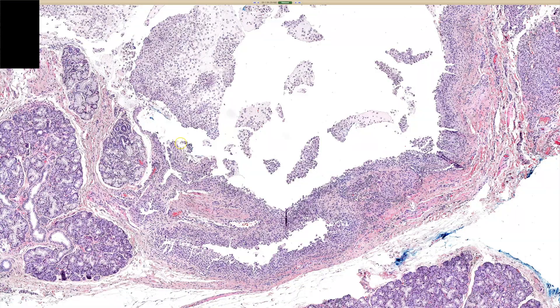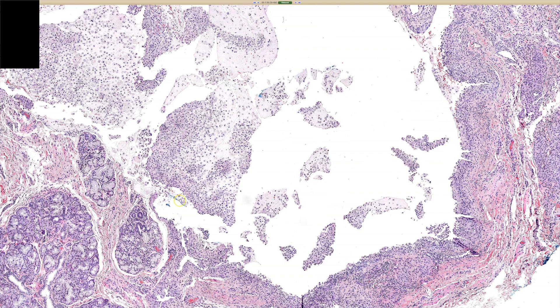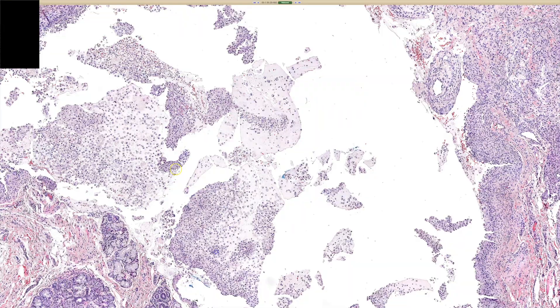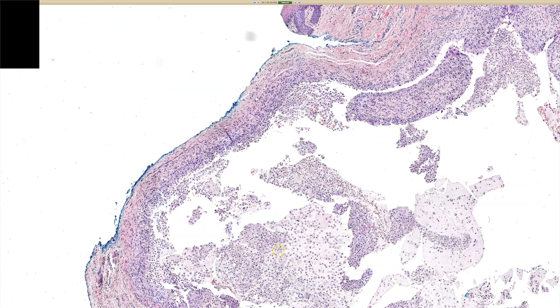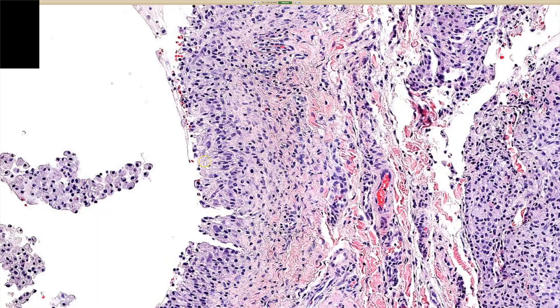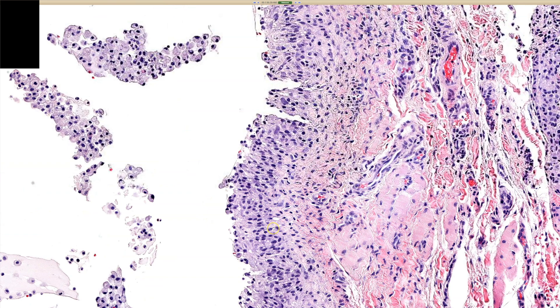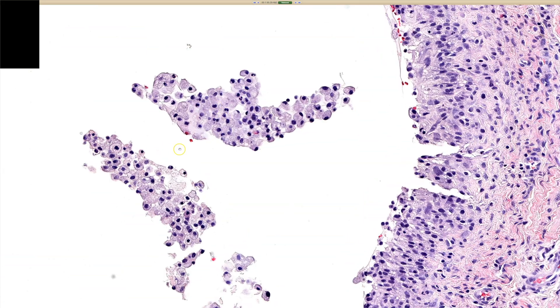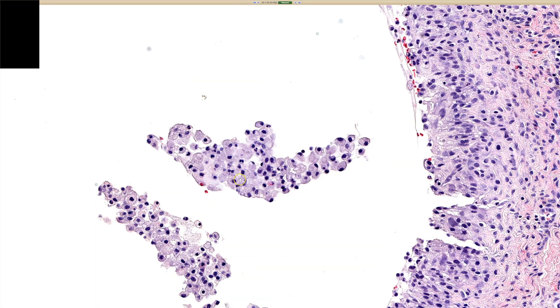What has happened is that one of the salivary gland ducts has gotten blocked and then ruptured. As it ruptured, it spilled out the mucus secretion, and that has made a pseudocyst. So what we would think was a cyst lining is actually not an epithelial lining at all.